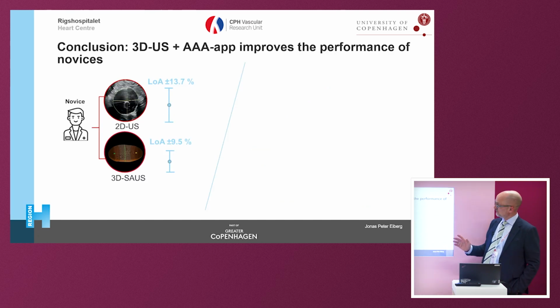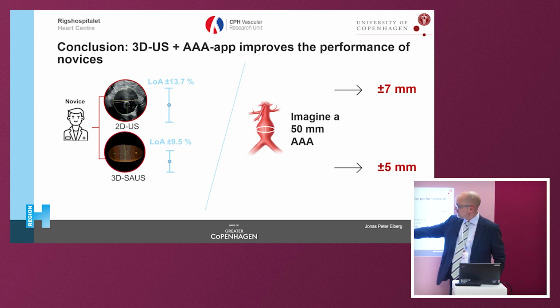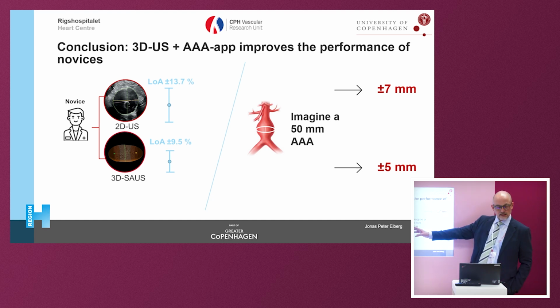So, I'll stop talking in a moment. The conclusion: giving novices this 3D tool would significantly improve their performance. And from this to this. And what does that mean in clinical reality?